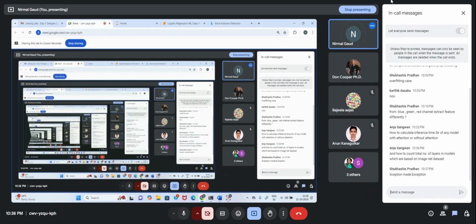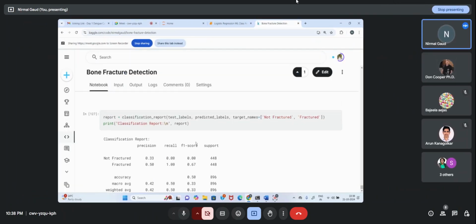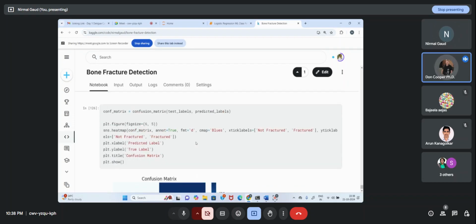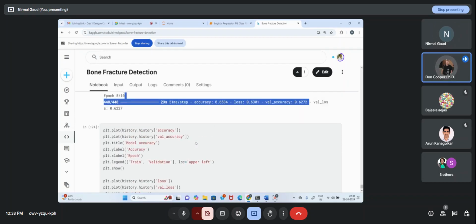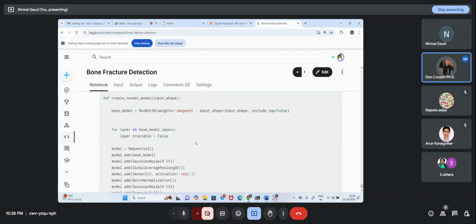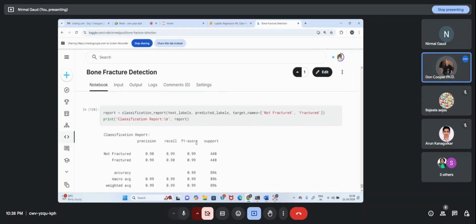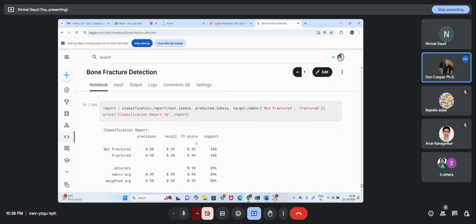That's what it did. I had a question. Yes, sir. So for Xception now, I suppose what we might be able to do on our own is to go back and look and see whether RGB makes a difference on Xception, or adding the noise makes a difference. Yes, sir. We can go back and do this, sir.